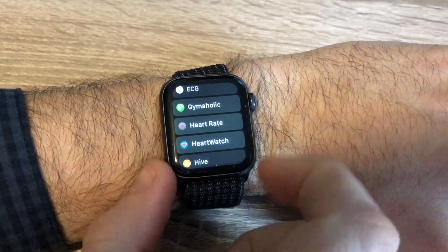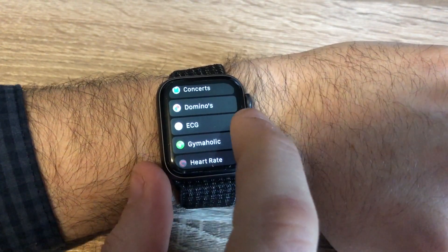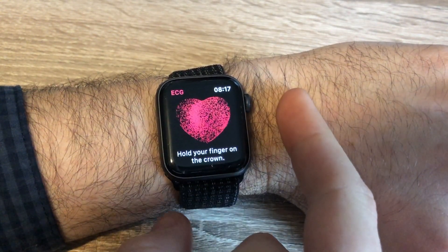Secondly, go onto your watch and you'll find a brand new app called ECG. Tap into this and if it's the first time you're using it, it will prompt you to open the Health app on your phone. On the Health app, you'll simply put in your date of birth and it will tell you a few things about the ECG feature, and you'll be ready to go.